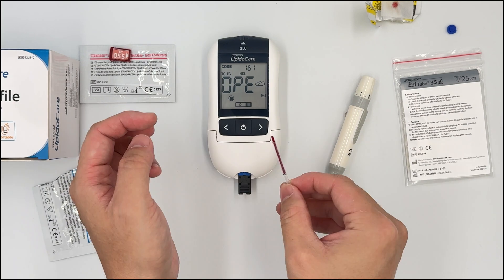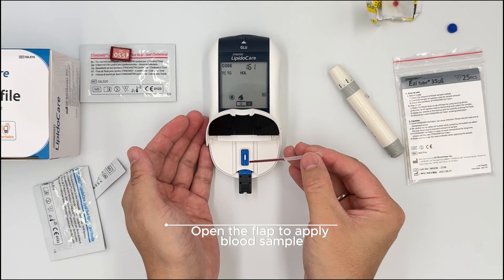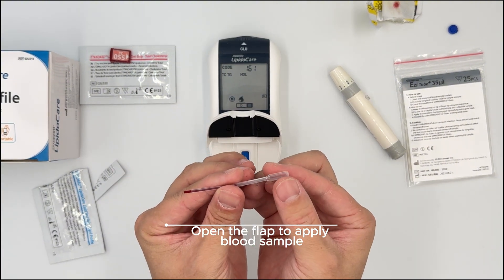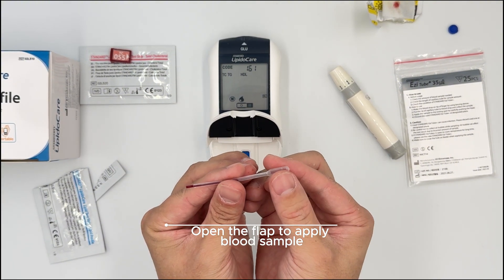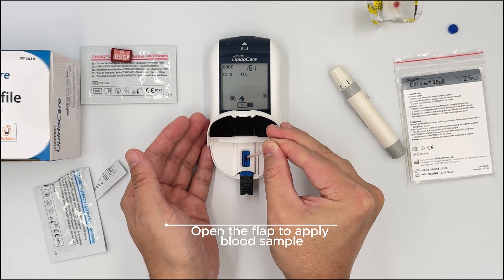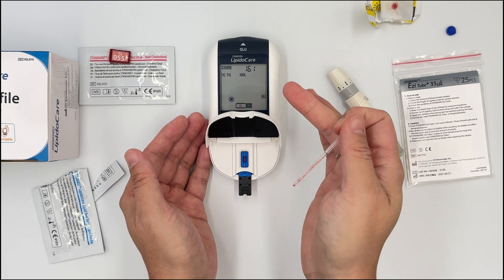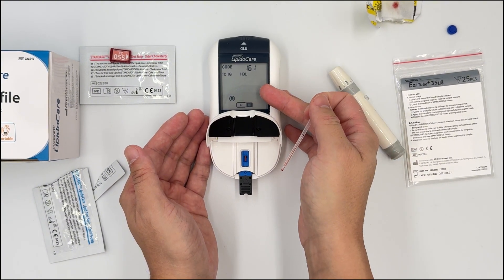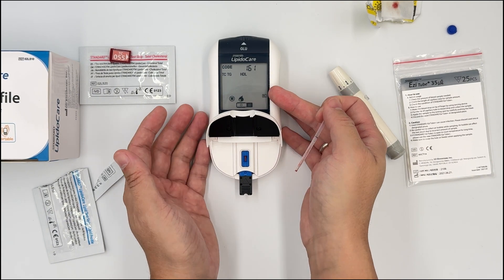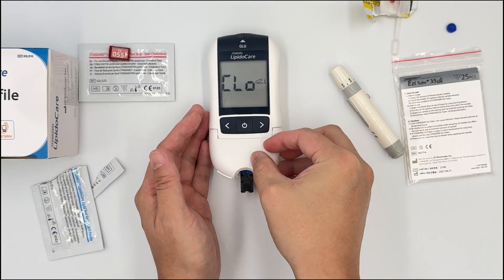Once you're ready, open the cover — it will ask you to insert your blood. Hold the head of the easy tube and close the hole, then drop the blood one shot into the strip. You have to wait for the machine to display 'CLO' before you close the flap. The blood is being absorbed into the test strip, then it will ask you to close.